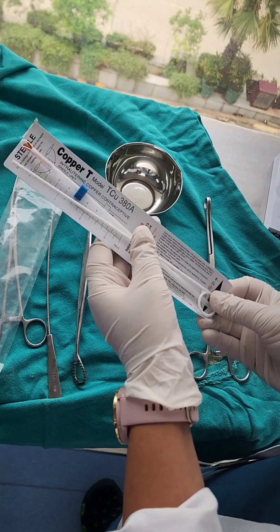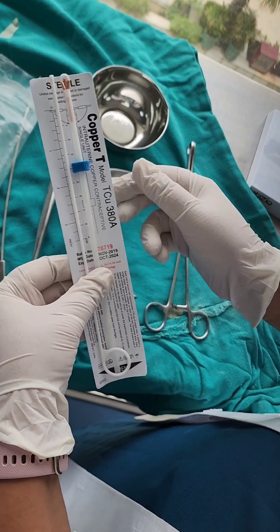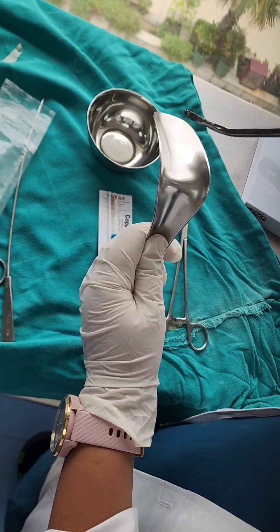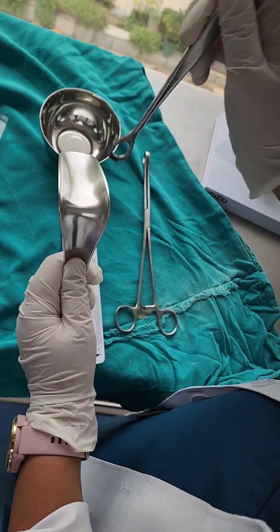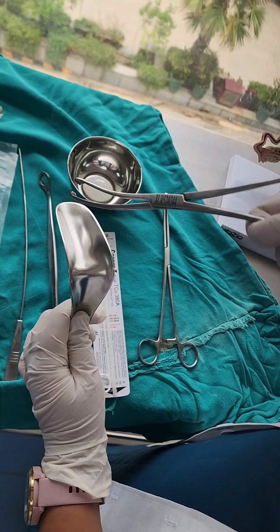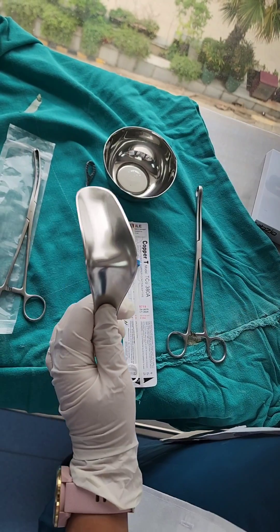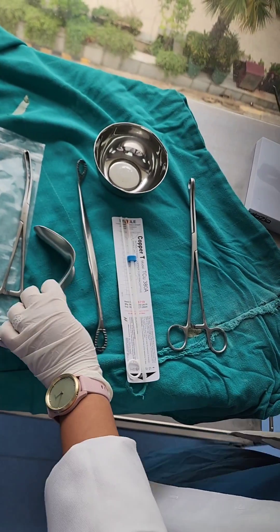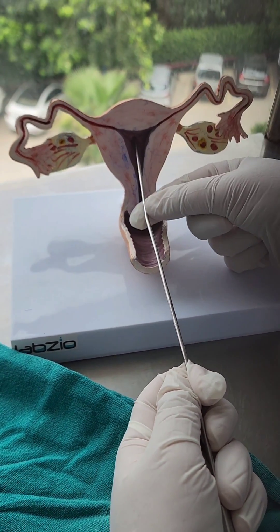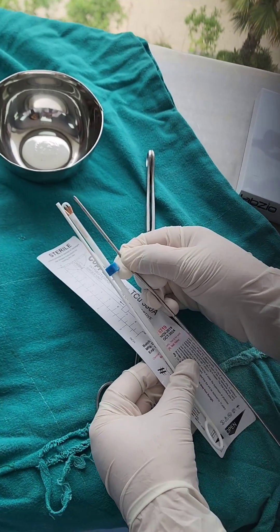Now we open the copper T packet and take it out. The next thing we have to do is measure the utero-cervical length. We put in the speculum, retract the anterior vaginal wall, visualize the cervix, and hold the anterior lip of the cervix with a Valsellum or a tenaculum. After doing this, we insert the uterine sound and measure the utero-cervical length.